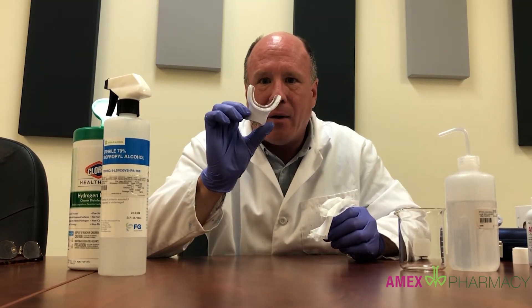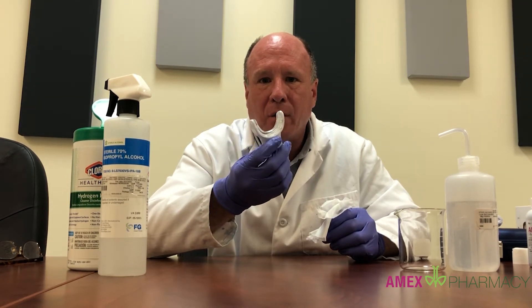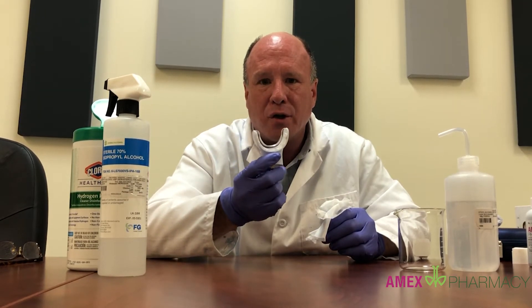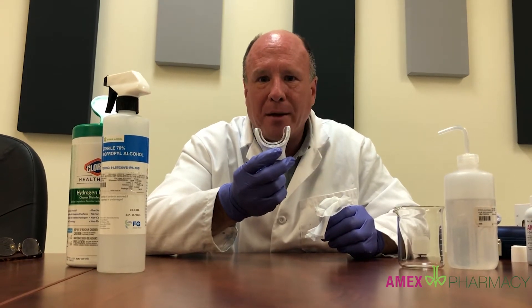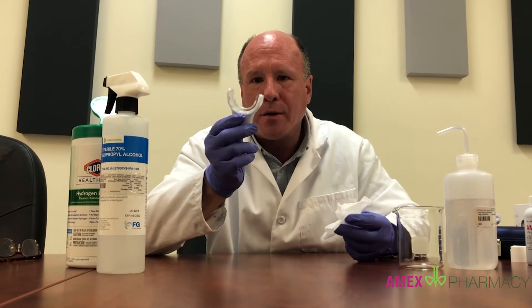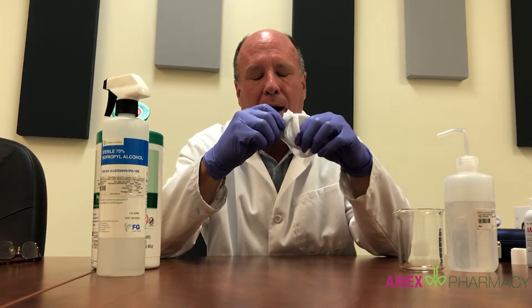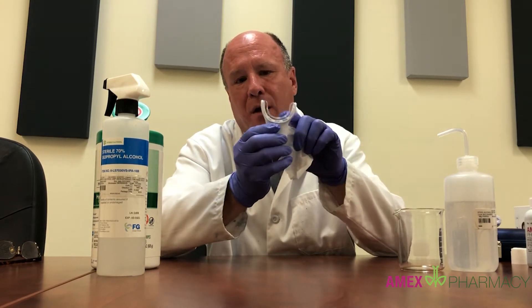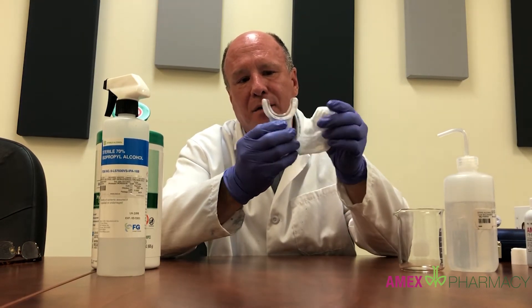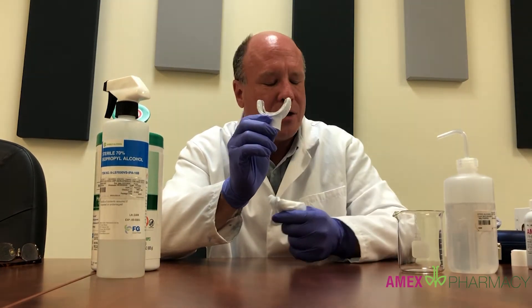This device — the mouthpiece — can get a little wet. It's okay to wash it off with soap and water according to the manufacturer's instructions, which are included. To get it a bit more clean than just soap and water, we also recommend using a hydrogen peroxide wipe to carefully wipe the inner surfaces around where your teeth and mouth go, then set it aside to dry.